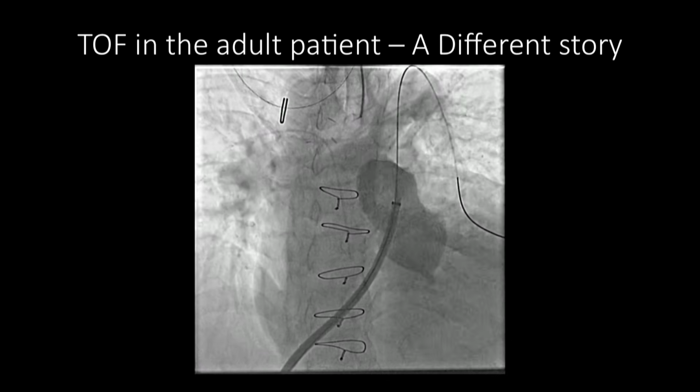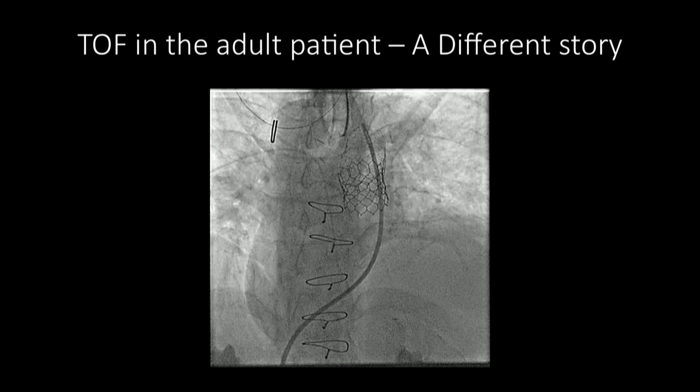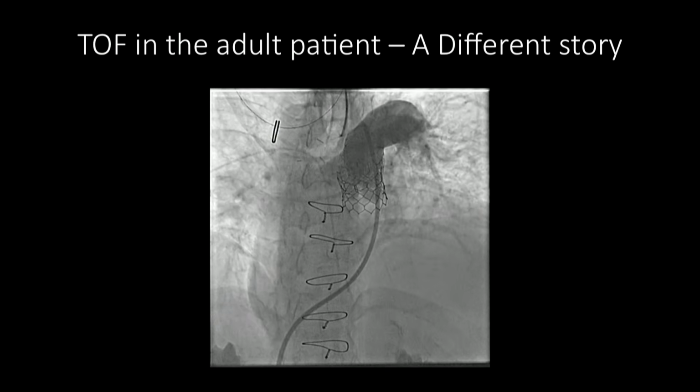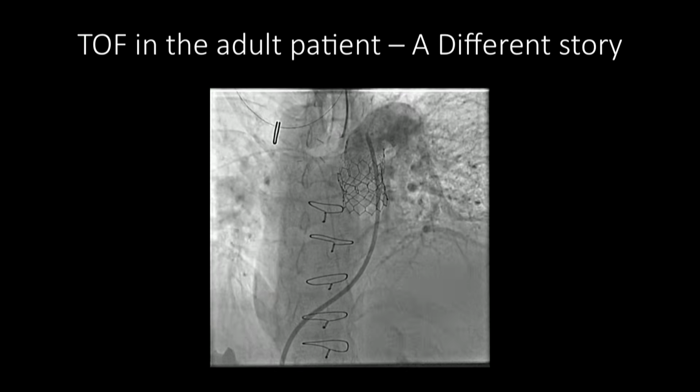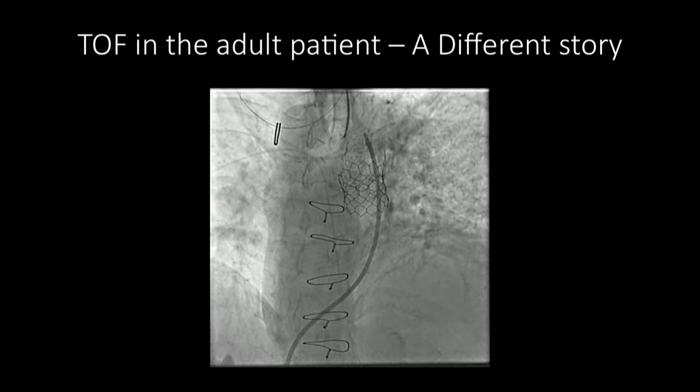So that's why we need to know this ahead. And this patient had a percutaneously placed valve, and you can see now that after injecting in the main PAs, we don't see any regurgitant flow to the right ventricle.